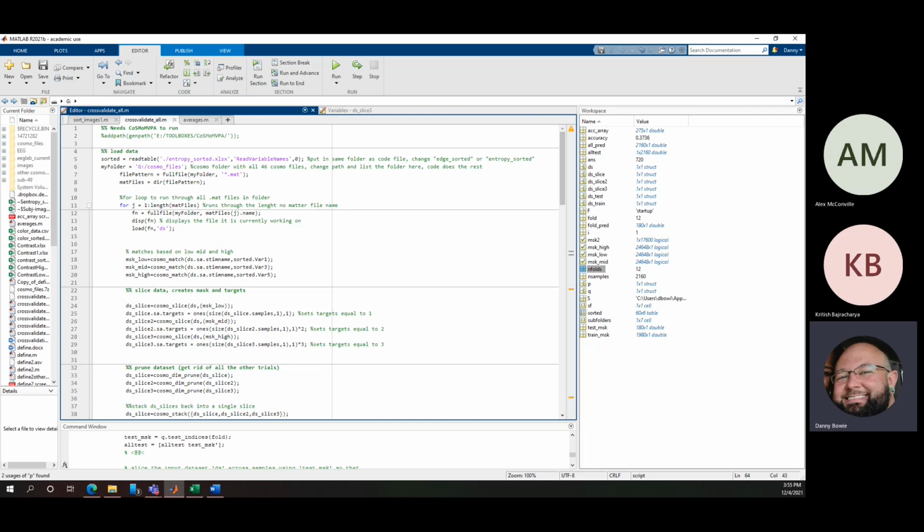In this example, the data was split into 4 subsets, where in our experiment, the data was split into 12 subsets and then folded each time. This allowed us to see if the algorithm could predict the brain's ability to recognize image features based on EEG responses.